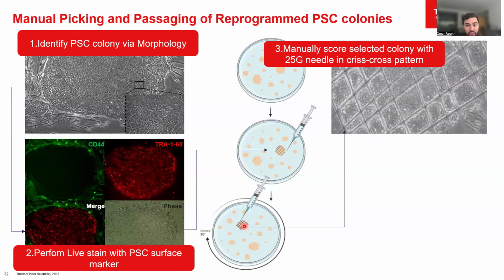And I should mention here that how big those squares are matters, right? So it takes a little bit of practice, but if you wanted to, you can even do it just on regular plastic without cells, just to get comfortable with the motion. You can think about it as making sheets of cells in those small squares. And the idea is that once I've cut these cells into small sheets, I can then transfer them over as clumps and have them be propagated in the next plate.